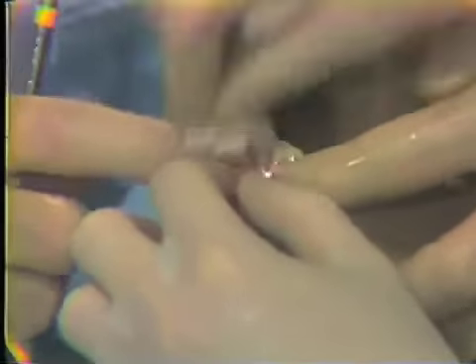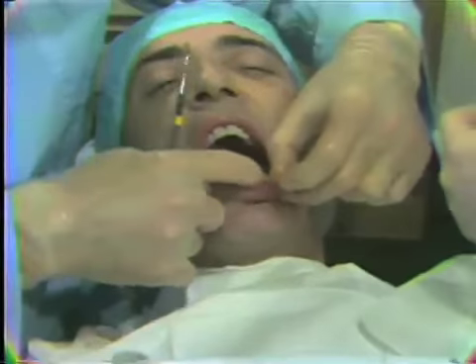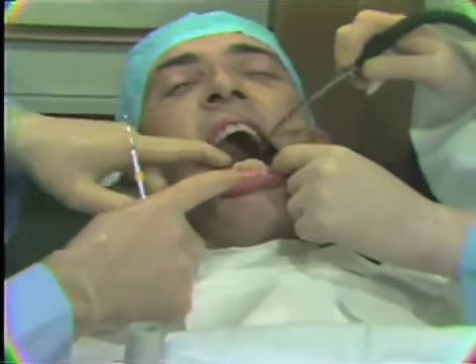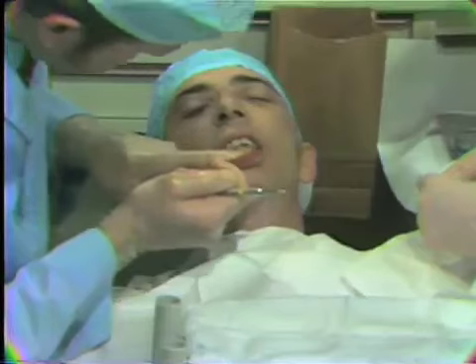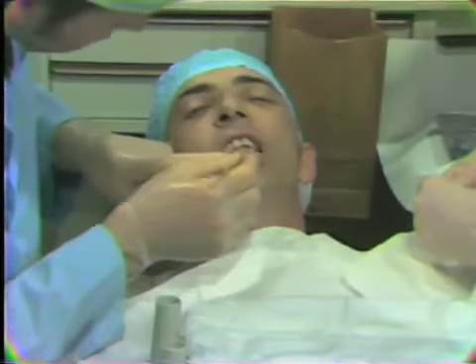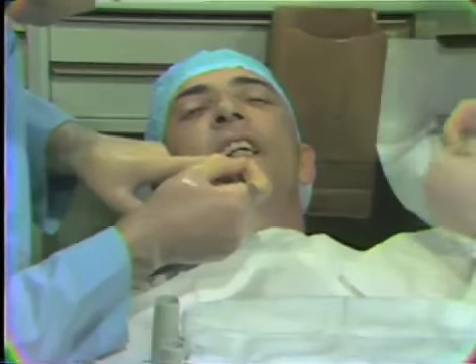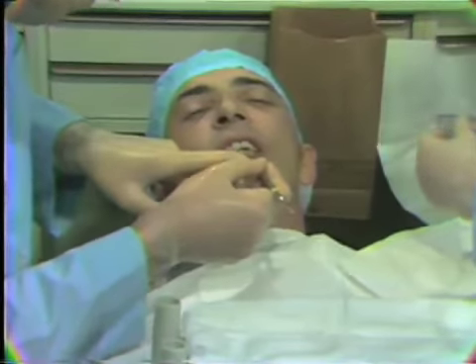Smoothing the dressing so that it does not tend to irritate the patient's cheek, and then cleaning the area finally with a saline sponge so that we have a chance for a final view of the dressing placement. Close together, please, all the way on your back teeth. Noting then that the dressing is clear of the patient's occlusion, and it seems to be well adapted into place, covering the surgical site and utilizing the areas of retention in the interproximal areas and around the teeth.